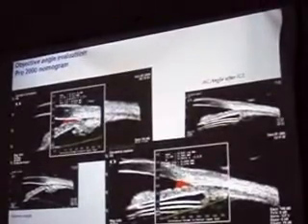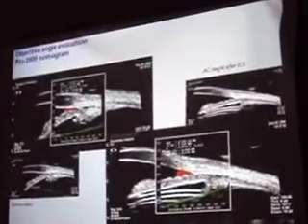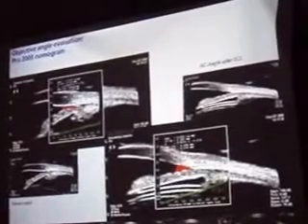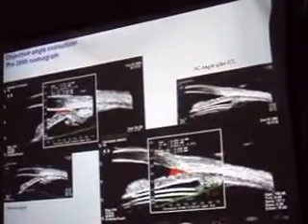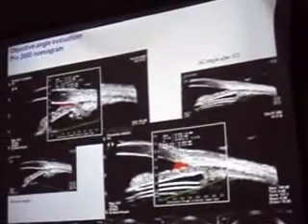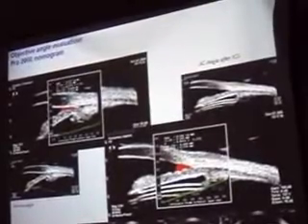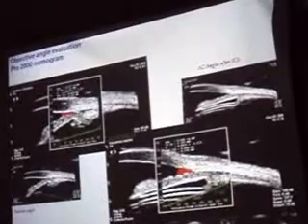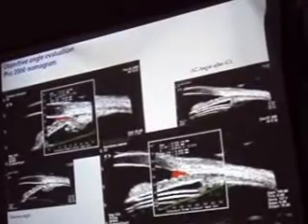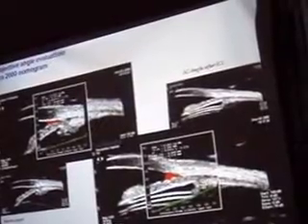As you can see, this is what we call the Pro 2000 nomogram. It's an angle evaluation. So far, the anterior chamber angle has been evaluated with the angle caliper, just telling you it's a 15 degree, or a 25 degree, or a 40 degree angle, which is a concept that is very difficult to follow. We are trying to match a regular geometric figure like the angle caliper, which is a triangle, to an irregular anatomical anterior chamber angle. You know, the anatomy is not regular. It's curved lines that we're trying to match with a straight line.